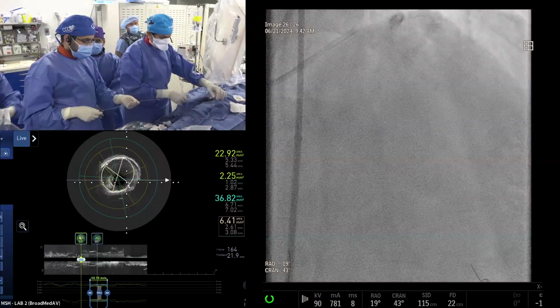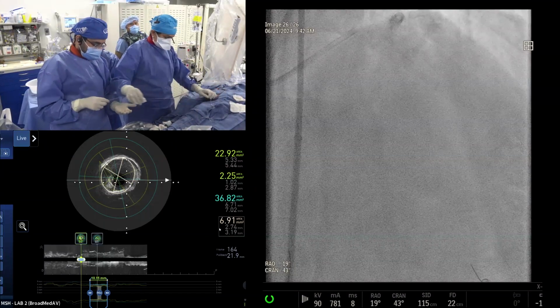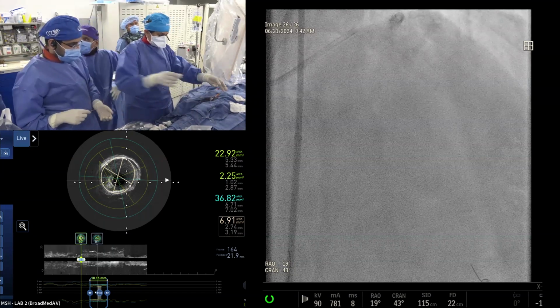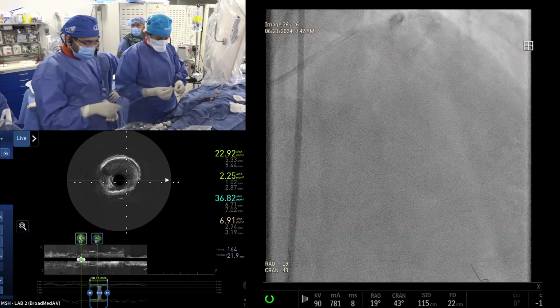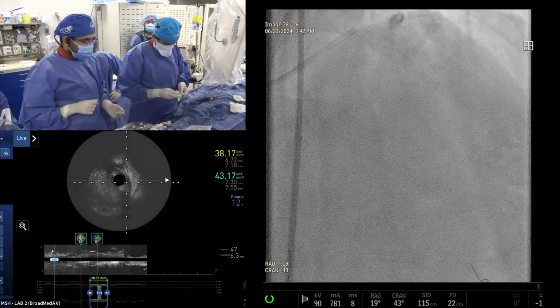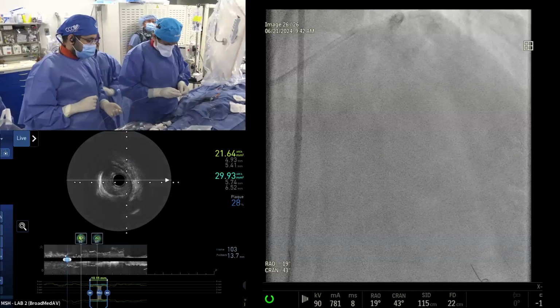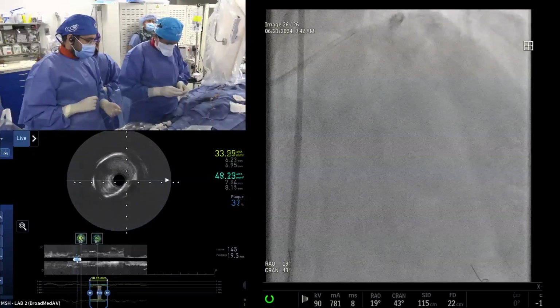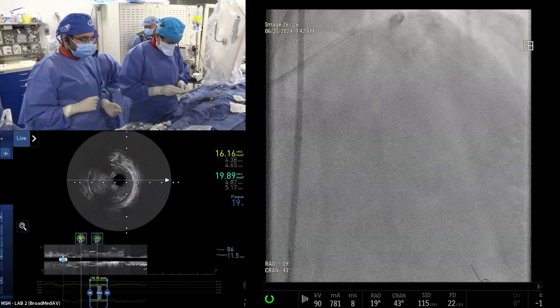we used rotational atherectomy combined with cutting balloon or high pressure balloon, in 60 patients, and the primary endpoint was MSA comparable with the balloon versus cutting, and we found no difference in the MSA. We presented last year, published in EuroIntervention, the RotaCut trial. There were no complications in 60 patients, just to tell you how good the techniques have become. These were 60 patients with complex native vessel disease, none of them ISR, with a lesion length of 28 millimeters.